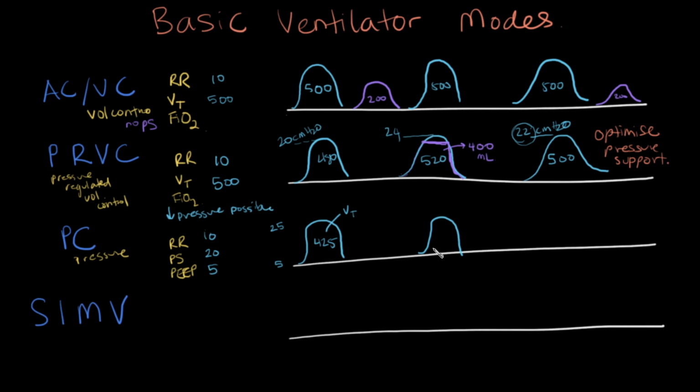And each breath might change depending on the patient's disposition, depending on what is happening in their lungs. So you might see progressively over the course of the day, the tidal volume might increase. And it might decrease. It might go down. And that is all going to depend on what is happening inside the patient's lungs, on the fluid status, and the compliance.